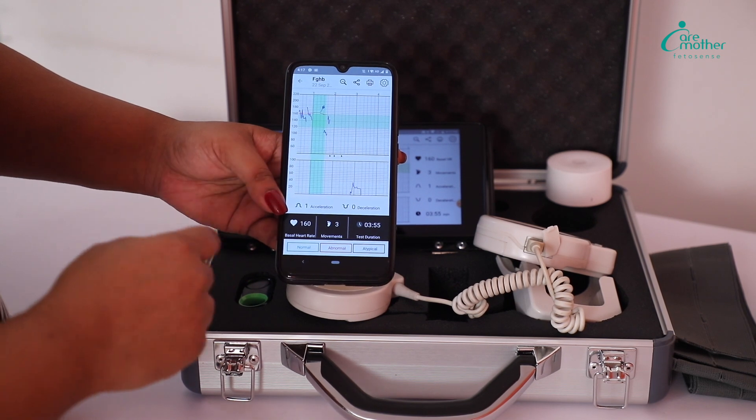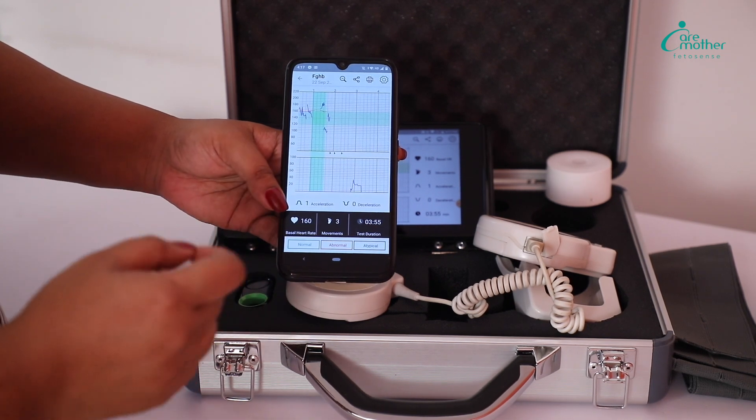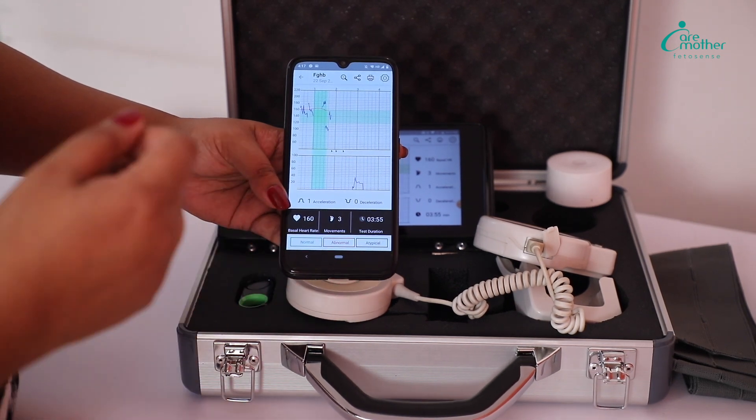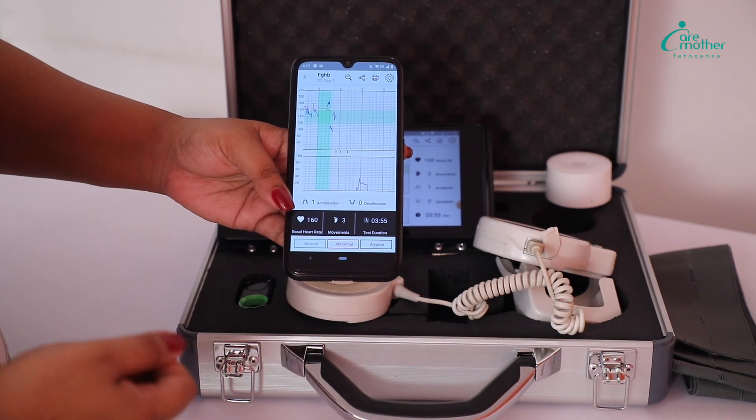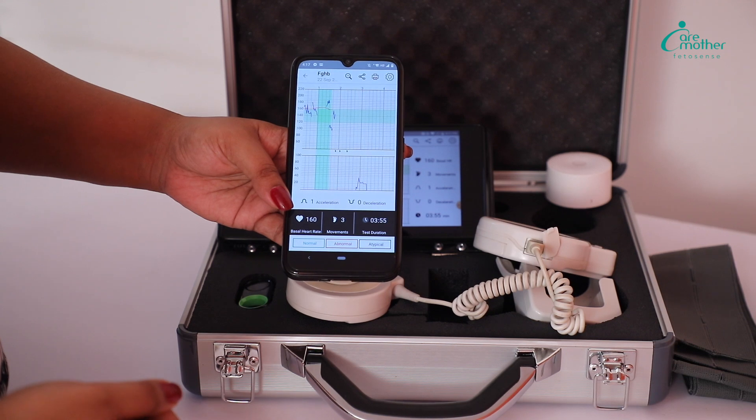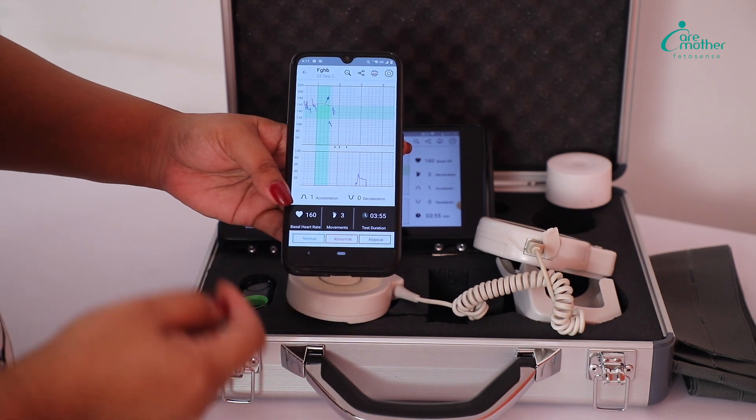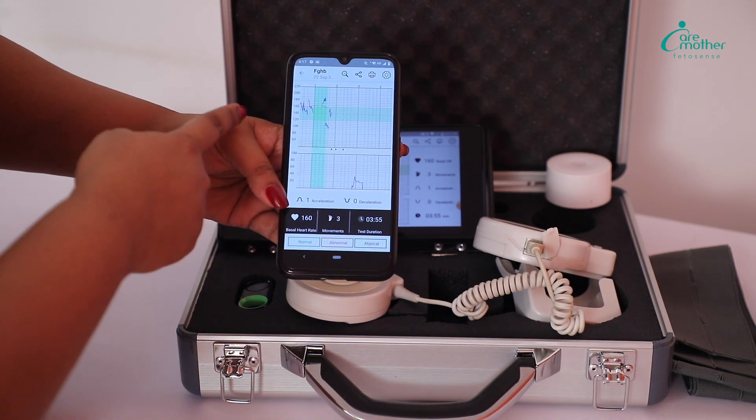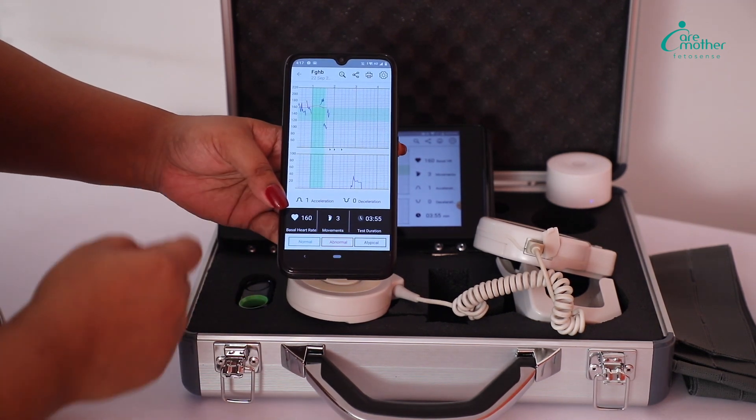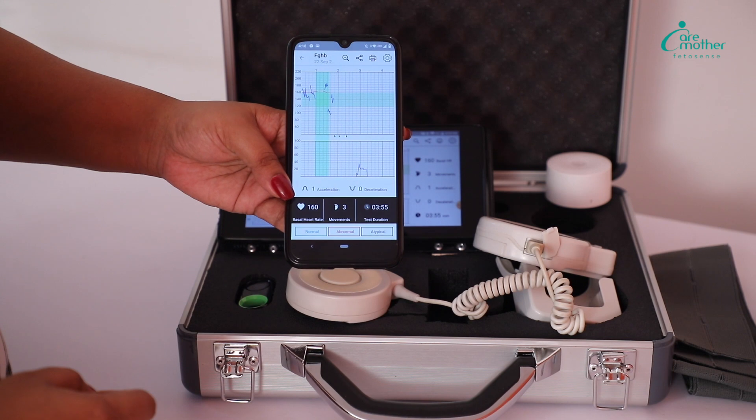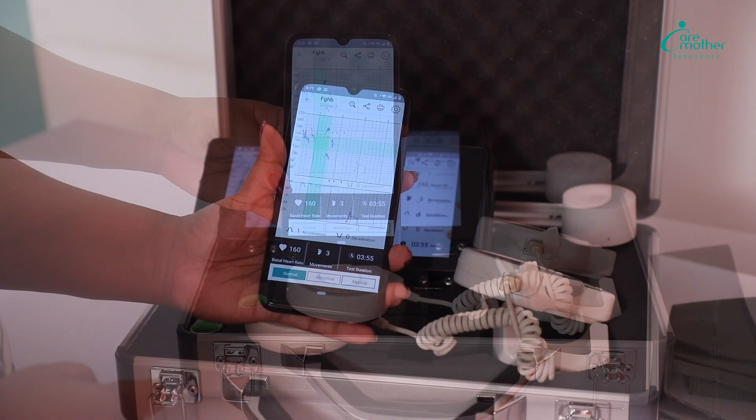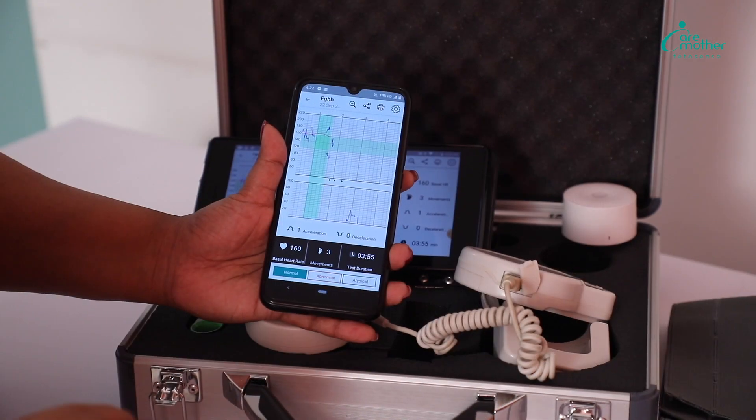This phone can belong to the doctor and the doctor can be away from the facility and away from where the test is being done. Yet, he will be able to see the test real time on his phone like this.